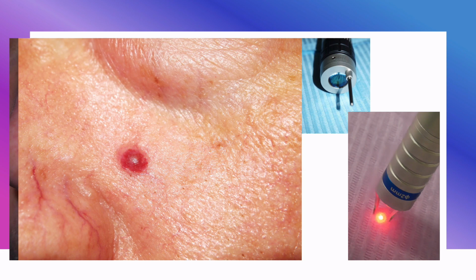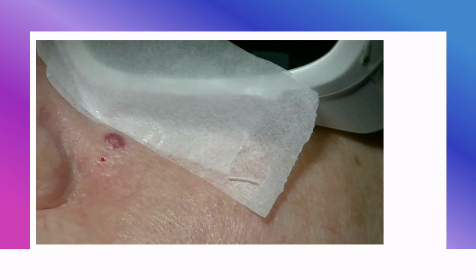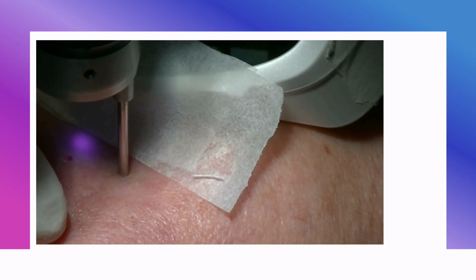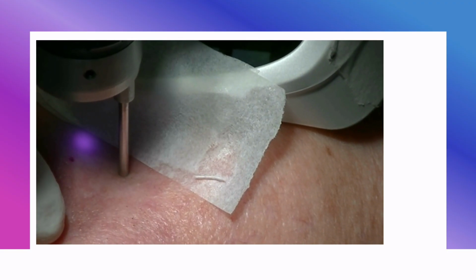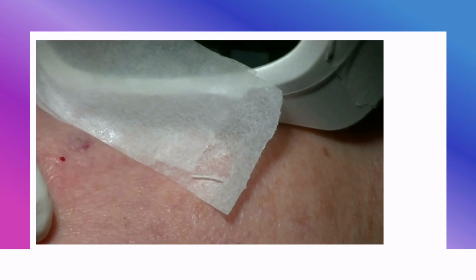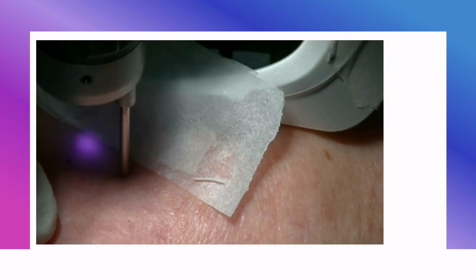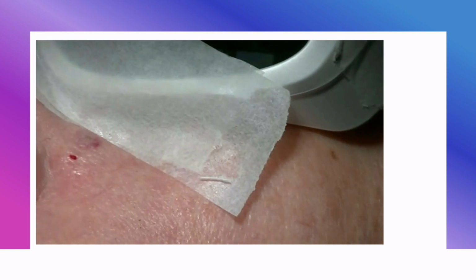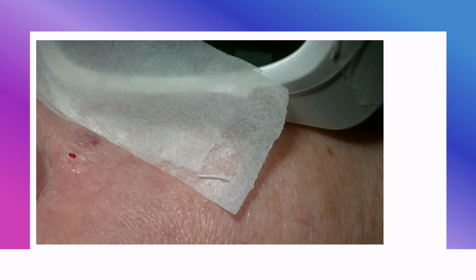A specifically designed optic for vascular application can be applied both intraorally or extraorally if needed. After the induction of a moderate amount of local anesthesia without vasoconstrictor, some impulses of laser energy are released until we see a sudden change in the superficial color of the vascular anomaly. We must wait until it turns from violet to white, just like in this case. Then we have to wait for the progressive healing.